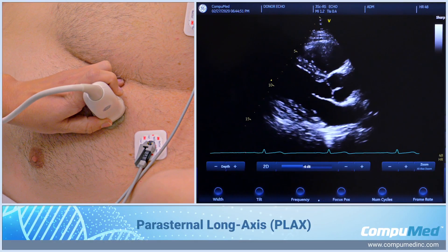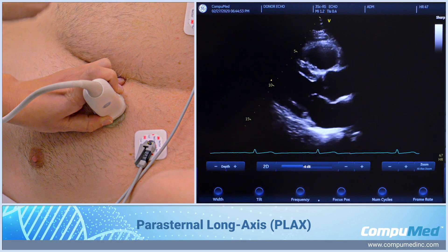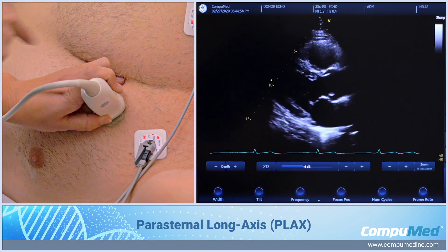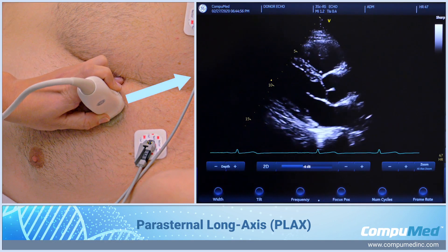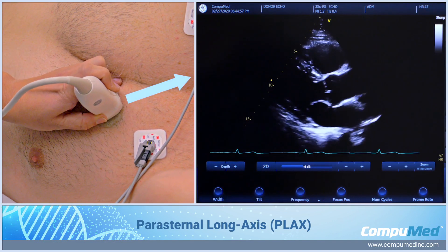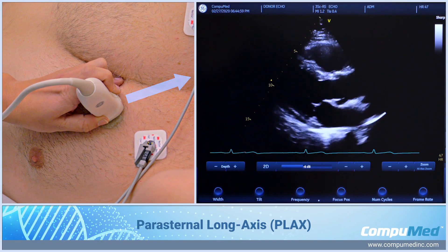Parasternal long axis. My index marker is pointed towards the patient's right shoulder towards 11 o'clock. I'm to the left of his midline on his chest.